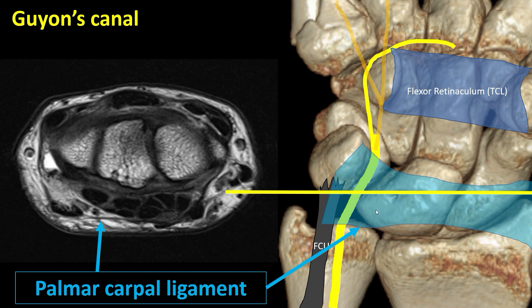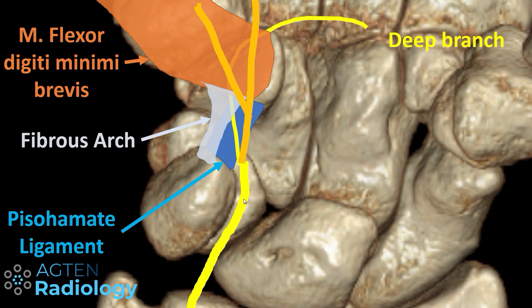The yellow reference line corresponds to this cross-sectional level, where we can see the ulnar nerve together with the ulnar artery. The flexor carpi ulnaris tendon is also visible, and above the nerve and artery there is the palmar carpal ligament, shown in the blue diagram. Once the nerve approaches the division into the deep and superficial branch, the superficial branch goes mostly straight ahead. Sometimes division into sub-branches of the superficial branch occurs already at this level, so there is some variety — trifurcations etc. — which we'll return to later.